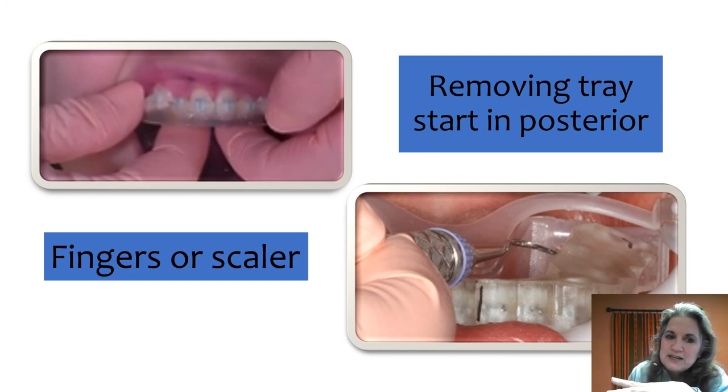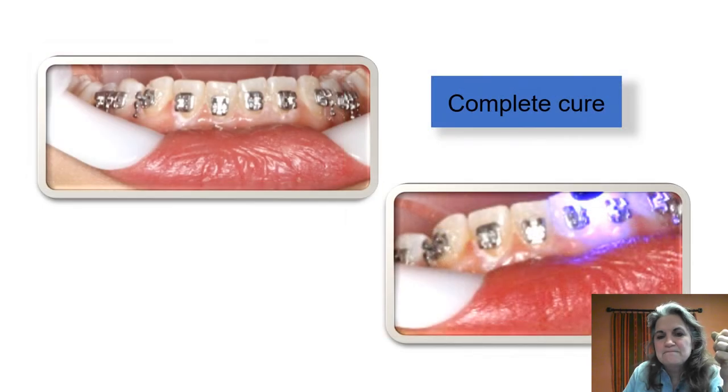There are different ways to remove the tray. Most of my staff likes to use their fingers, or I'll reach inside in the posterior and peel it off the lingual surface from the back to the front. Sometimes we'll use a scaler if needed — go from the lingual, reach to the back, lift it up, and then lift it off the anterior teeth. Once the tray is removed, go ahead and do a final cure.